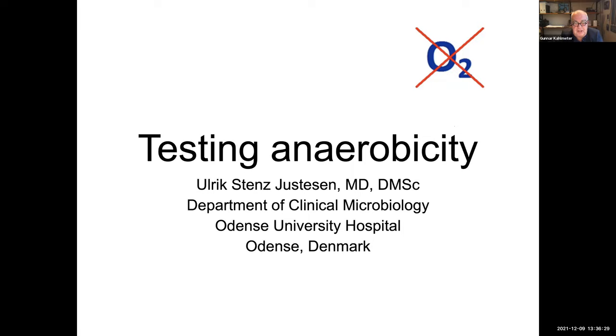So if someone is wondering why we make it work now when it didn't work previously, this is at least one of the explanations, the others being standardizing a number of criteria and recommendations for how to perform this. And the third reason is that we have limited ourselves to a few species. We're not claiming to have developed a diffusion method to which you can take any anaerobic species. So I think those are the three main reasons for why this is actually working.